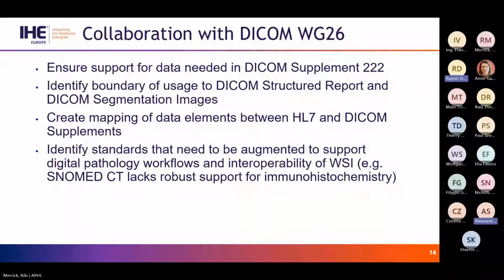DICOM Supplement 222 is the most recent release for pathology that focuses on digital annotations. And so there's been close collaboration to recognize how these standards can best be leveraged to support the use cases in the PaLM integration profiles.